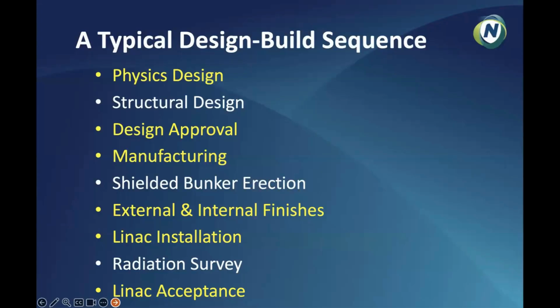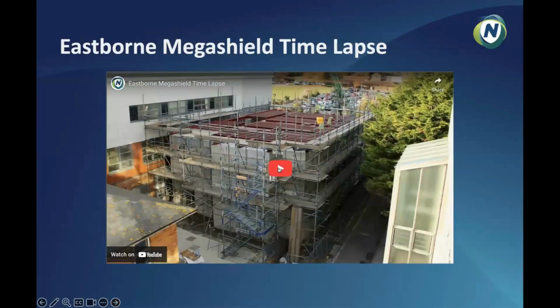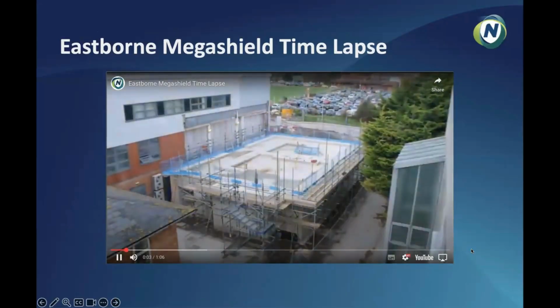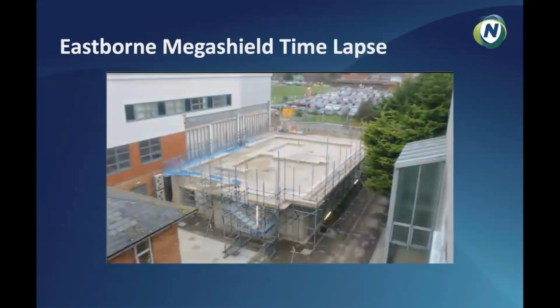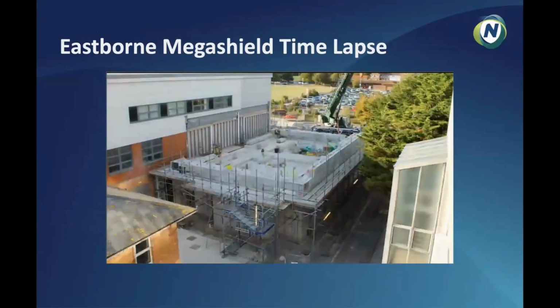Then you can do your testing of the shielding and the physics and everything that's come before that, before you accept your Linac. I've got a video here. I'm not sure if it's going to play, but we'll give it a go. This is just a time lapse of a mega shield installation, which is the largest block that Nelco produce going up. So I'll just play that quickly so you can get an idea of just how fast and how different it is to a traditional concrete pour bunker.